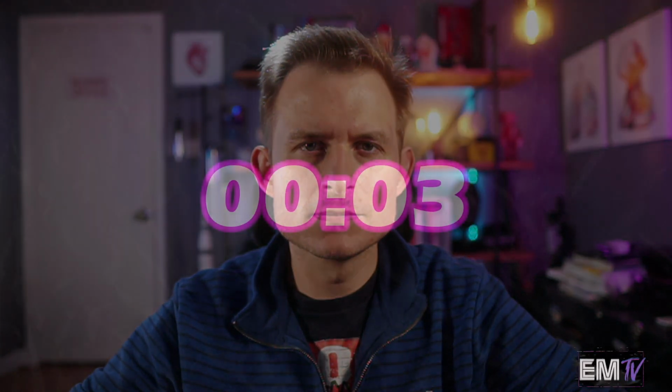I'll be giving you an ECG rhythm and a scenario. On the bottom of the screen you'll see a timer for 1 minute and 30 seconds. This time closely resembles the average amount of time you'll want to be spending on each card during an actual National Registry exam. When the time is up, we'll go over the rhythm and I'll give you my treatment. Enjoy the card and good luck. 3, 2, 1.